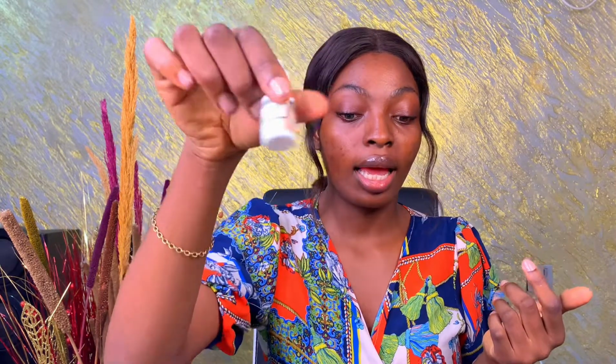And then now I would apply my eye drop. Just 2 drops is fine. Close the eye for a bit. So this one is in. I'm going to repeat the same process for the other eye.